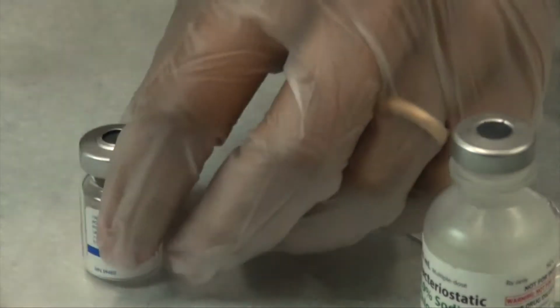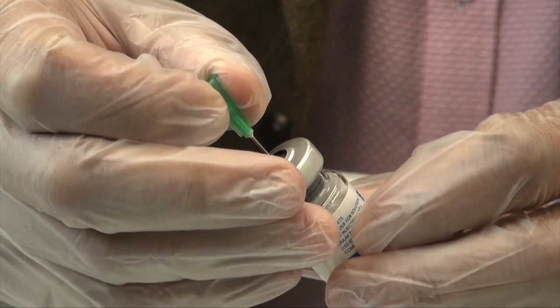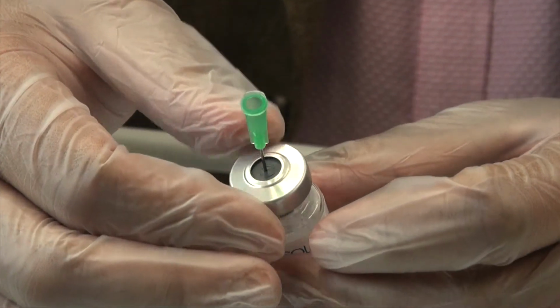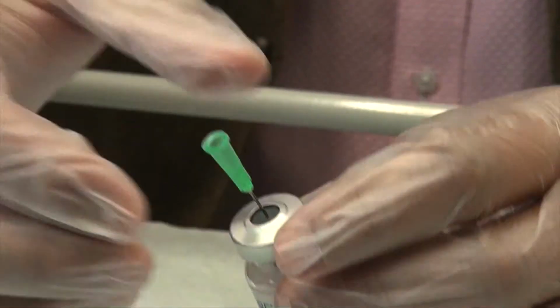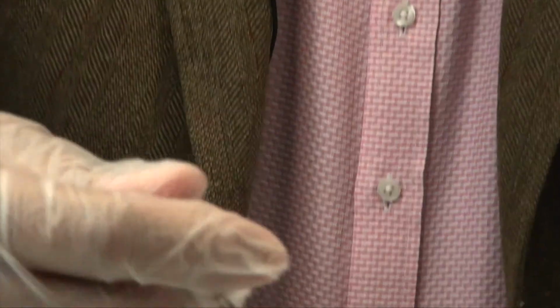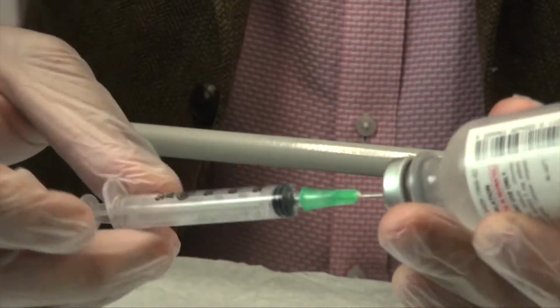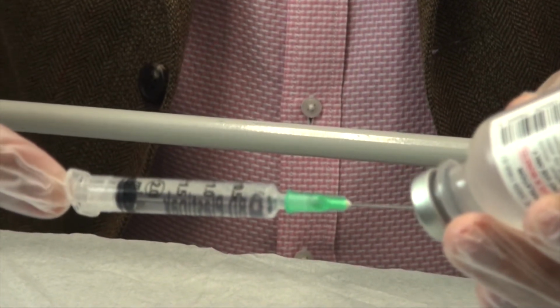With the Bocouture vial, again, I shall remove the vacuum. You hear that hiss? Two things can be confirmed. Obviously, the vial hasn't been tampered with, and now you have allowed the contents of the vial to come to atmospheric pressure. We take our 2.5 ml syringe, place the needle on the syringe, and again draw back 2.5 mils of bacteriostatic saline.